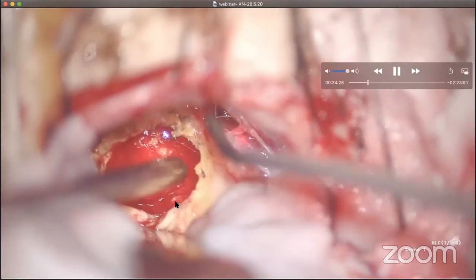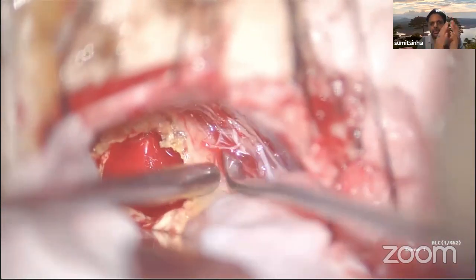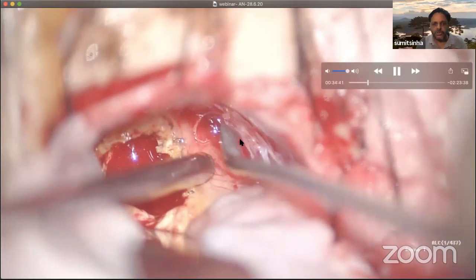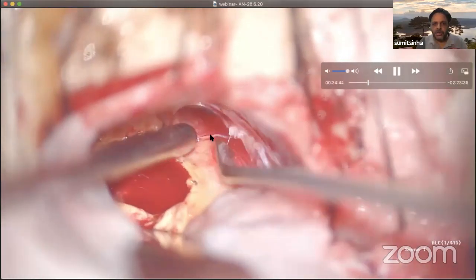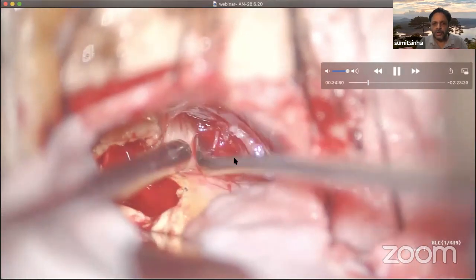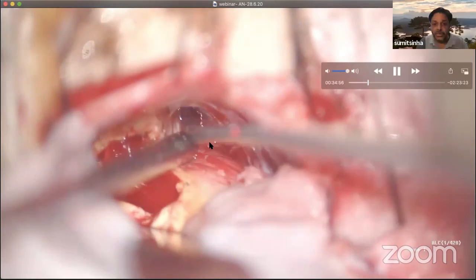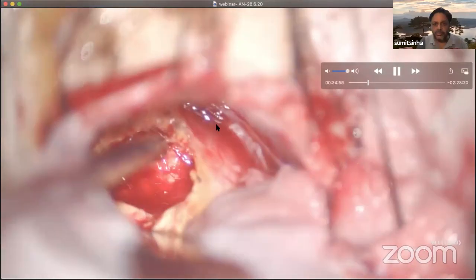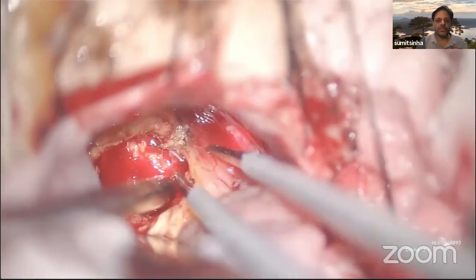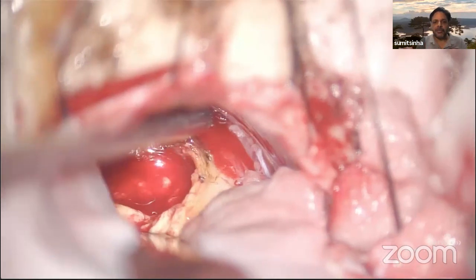So this surgery is all about decompressing or debulking the tumor, making the tumor manageable, making the tumor collapsible, so that you can then dissect the surrounding structures. Now you see that after having debulked over here, there is some space which has opened up near the lower pole, and this is what I'm doing. I am de-dressing the tumor from the lower pole here, taking care of important neurovascular structures. Important arachnoid here. You see this particular beautiful arachnoid membrane at the lower pole. So at no point in time during the surgery should the arachnoid be disrespected. It has to be respected and taken care of during the entire surgical procedure.